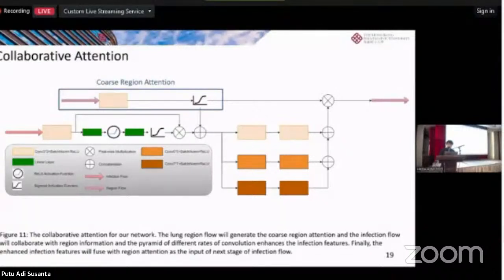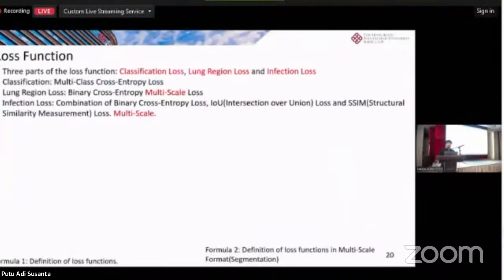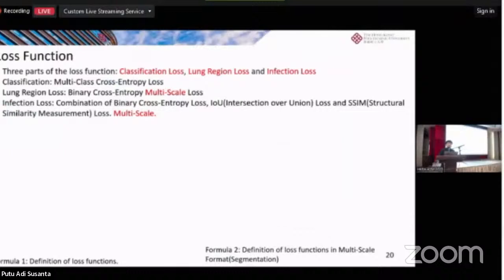and get the refined attentions after the collaboration and enhancement, and get the final attention using the differentiation and infection segmentations. And next, I will briefly introduce the loss functions used in our pipeline very quickly.